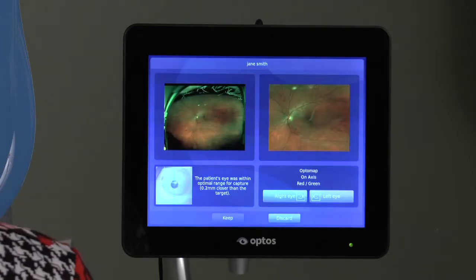Notice that the screen is divided into five areas: the wide field image at top left, a cropped image of the central pole at top right. Bottom left shows the alignment camera and indicates if the patient was within optimal range for capture, too far in, or too far out. Bottom right shows image type and allows the operator to assign appropriate laterality, and at the very bottom are the keep and discard tabs.